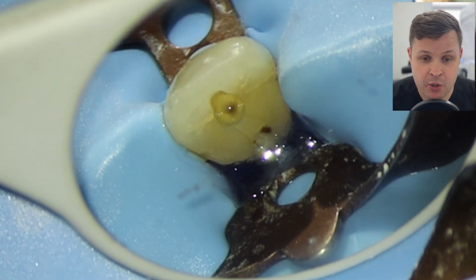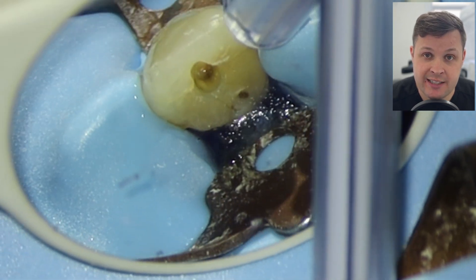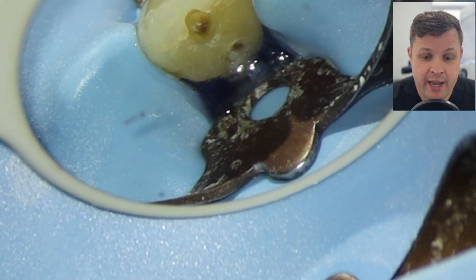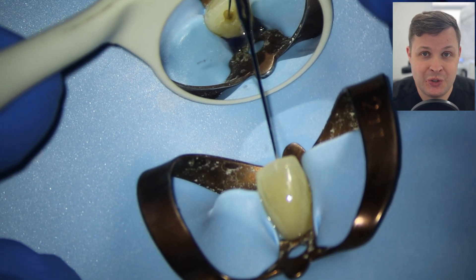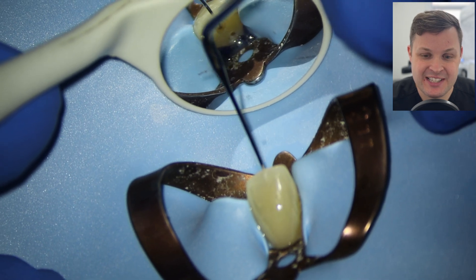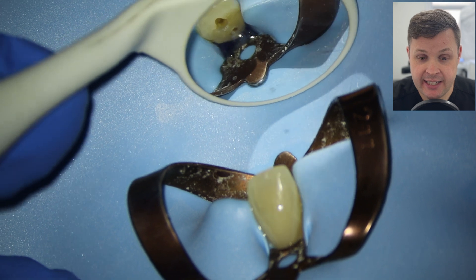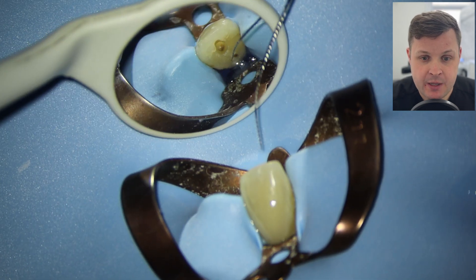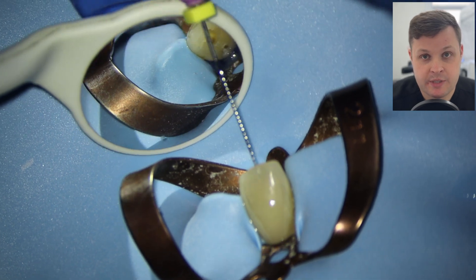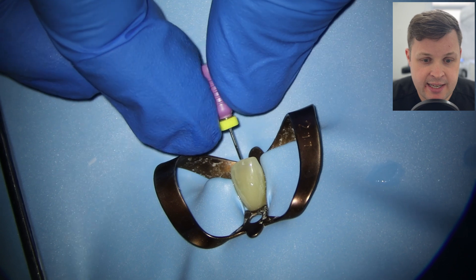This is a specific liquid dam that sets under ultraviolet light. Once we've put the liquid dam on, you can see the canal space is exposed. You'll also notice my access cavity does encroach on the incisal edge — that's because I've got straight-line access. It's a fine balance between destroying the incisal edge and getting straight-line access, and in this case it was a fine balance.